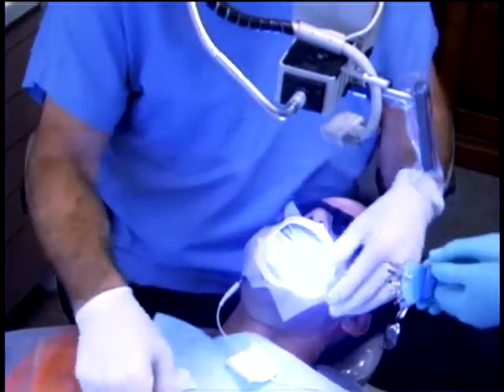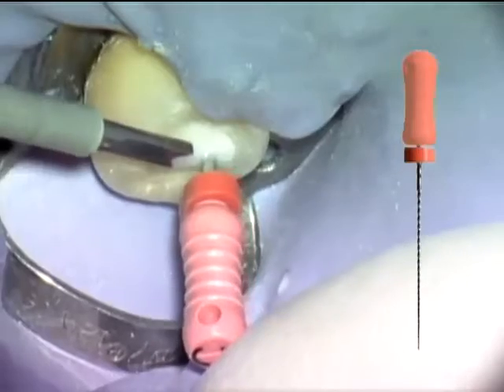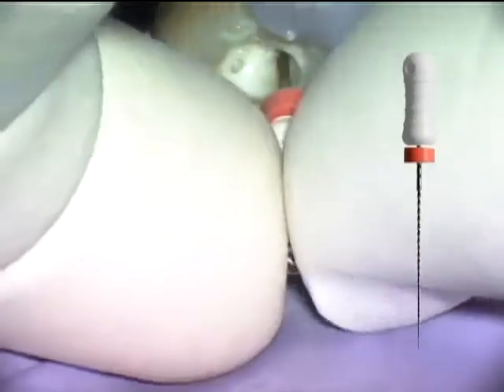As soon as the first negotiating file nears estimated length, the apex locator is brought into play to give feedback as to the position of that file relative to the canal terminus. In this tightly curved canal, a number 06K file was needed to reach near to length.